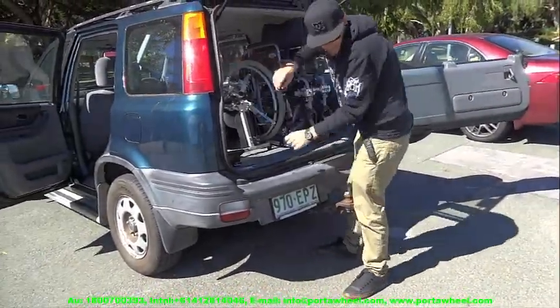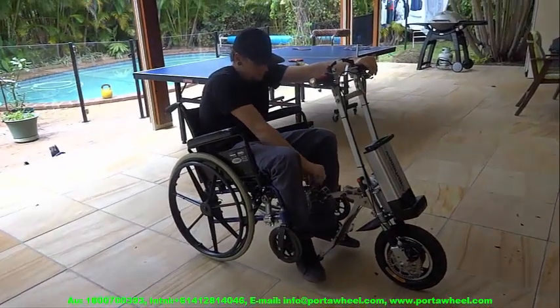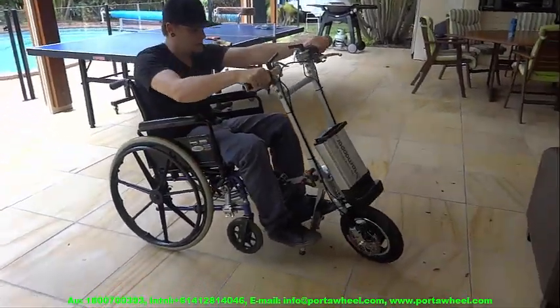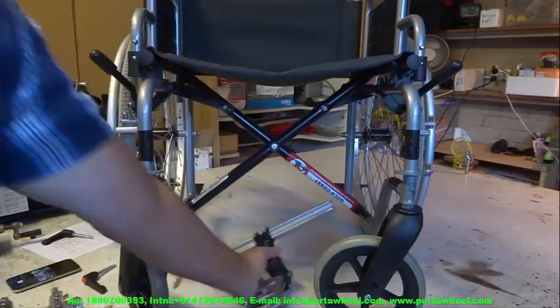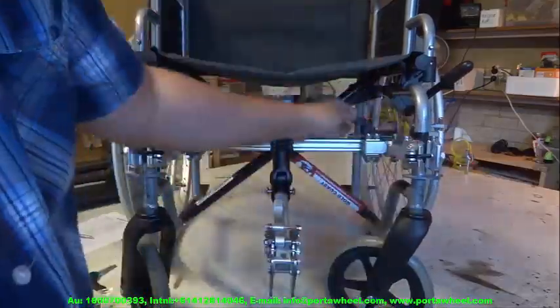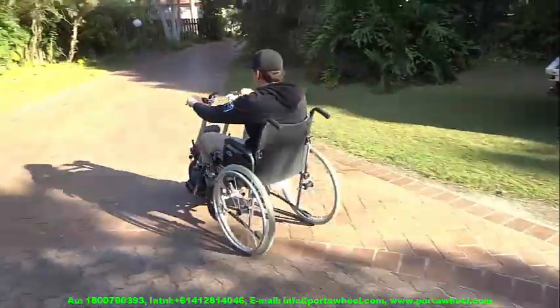The PortaWheel 380 is suitable for those weighing less than 100kg or 220lbs. With its 8.7Ah universally accepted flight-friendly Panasonic lithium-ion battery, it provides a range of up to 40km or 24 miles per charge, at speeds ranging from 1.5kmh or 0.86mph right up to 25kmh or 15mph.